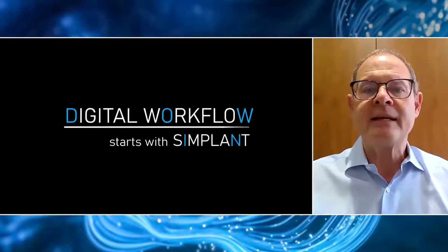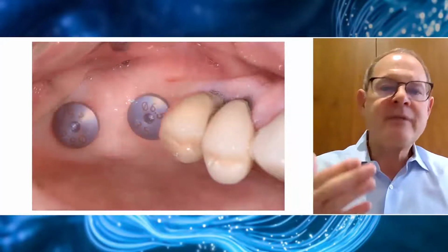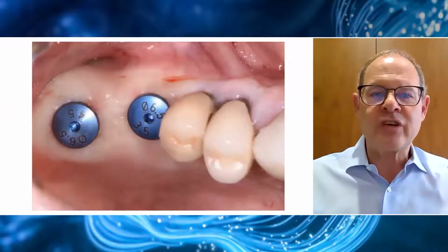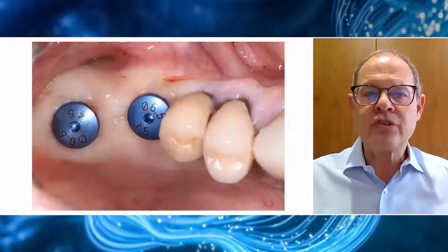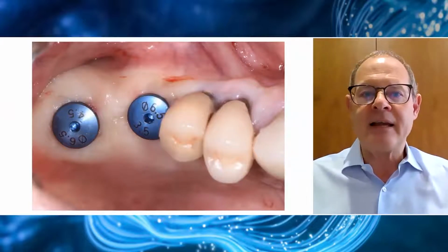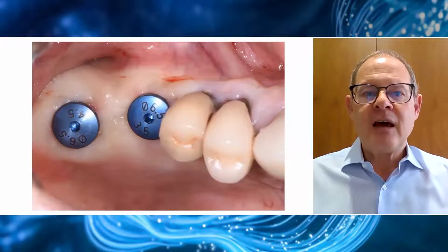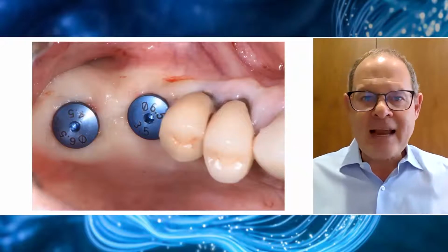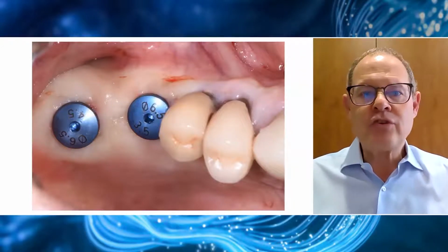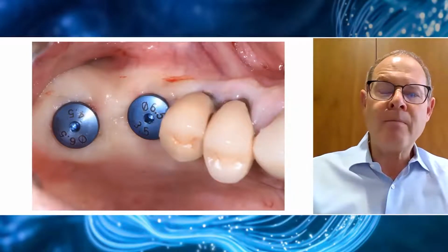It could be a pilot guide or a fully guided surgical guide that can then be taken to the mouth for surgery. Now, I don't have any images of the guide, unfortunately, but these 2 implants have been placed in a flapless approach using a pilot guide through punch incisions. So these 2 implants have been placed without raising any flaps, no incisions, no sutures, and this provides the patient minimal trauma and minimal morbidity.